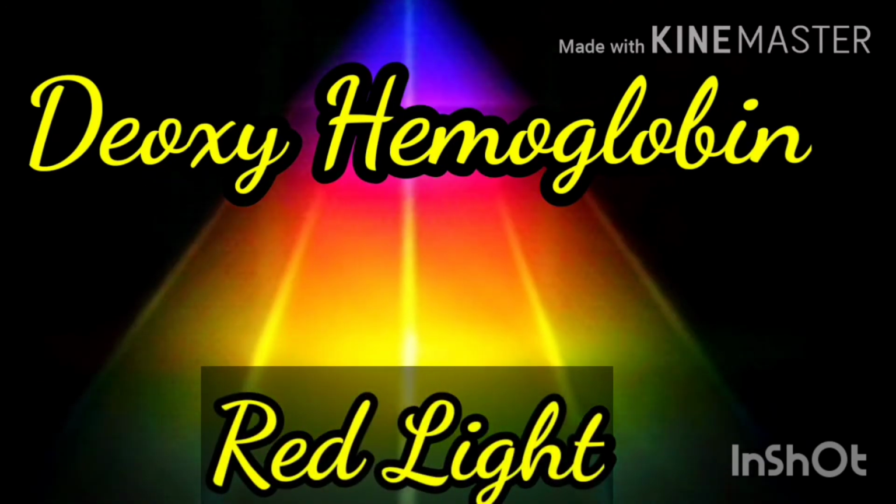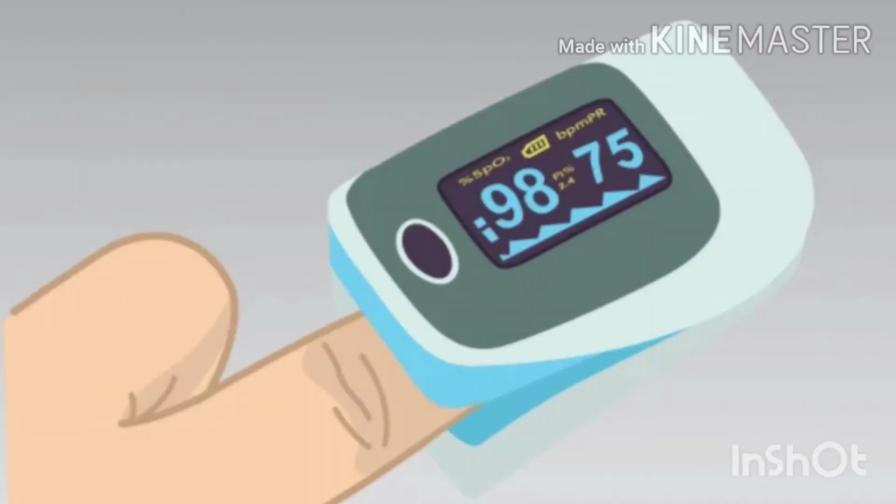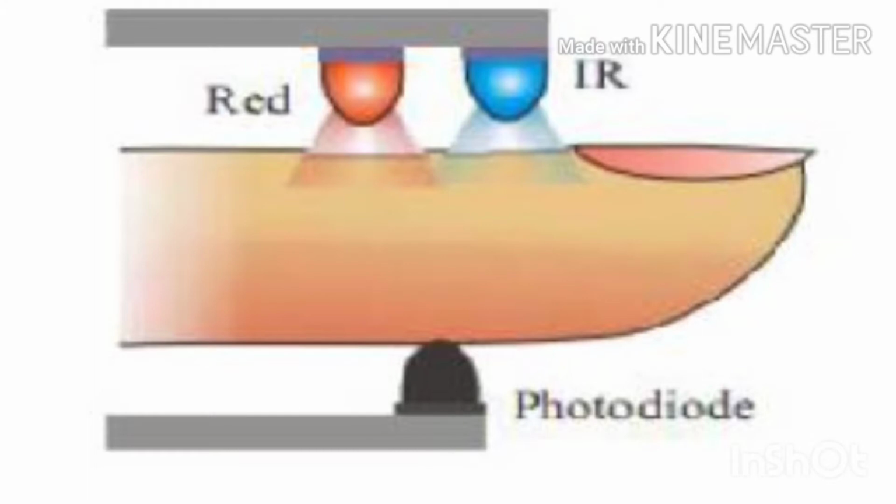So, whatever pulse oximeter we are using, this pulse oximeter contains two light emitting diodes. That is, one light emits infrared light and the other one emits red light.